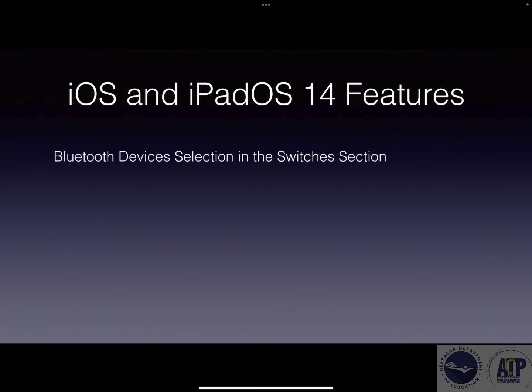One of the first features that was introduced was the ability to get to the Bluetooth selection in the switches section, rather than having to go out into settings, selecting Bluetooth, and then selecting the Bluetooth device that you want to use to control switch control.